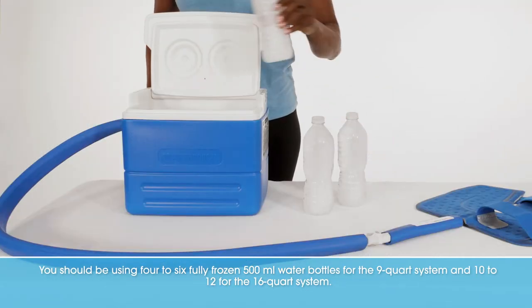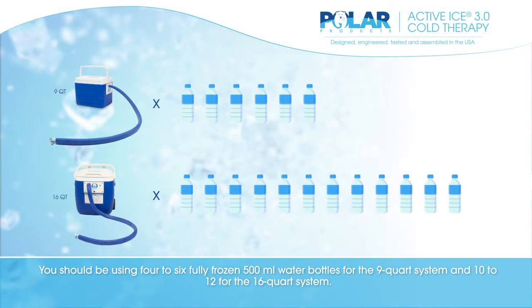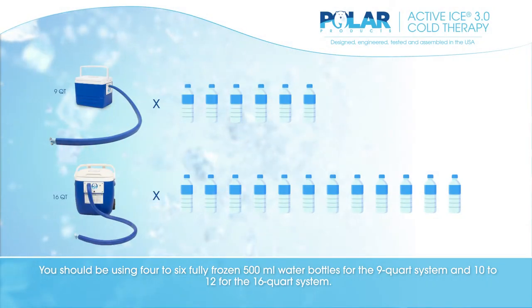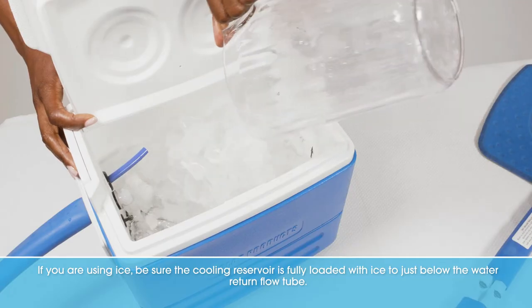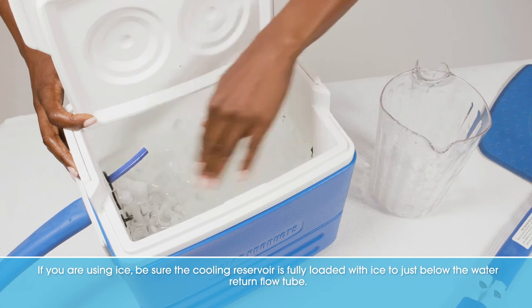You should be using 4–6 fully frozen 500ml water bottles for the 9-quart system and 10–12 for the 16-quart system. If you are using ice, be sure the cooling reservoir is fully loaded with ice to just below the water return flow tube.